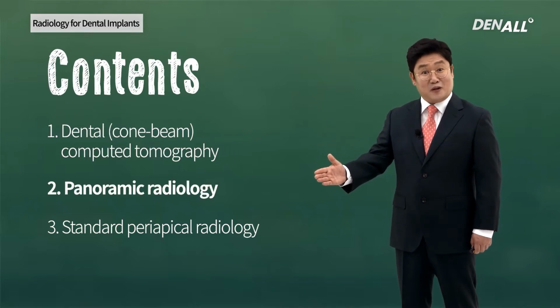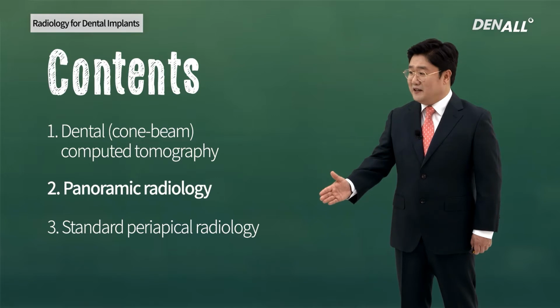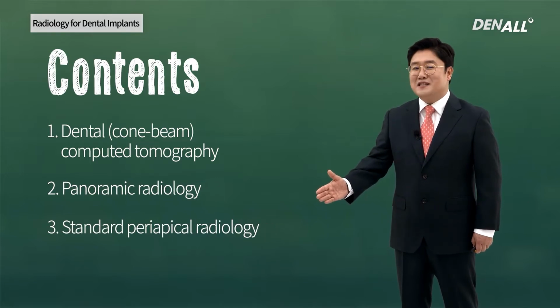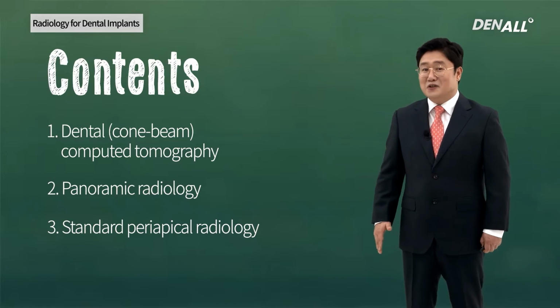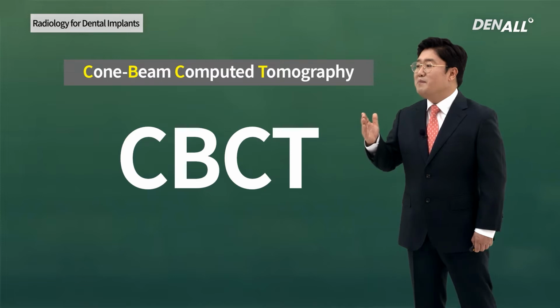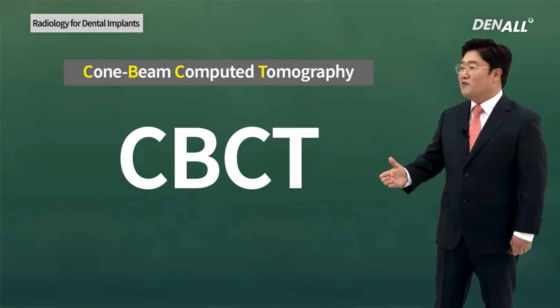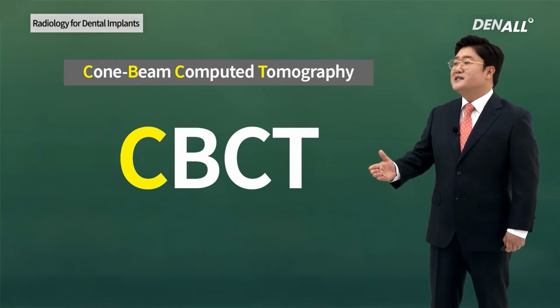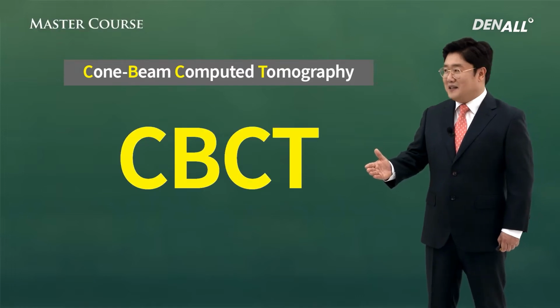Panorama, which you already know well. 3. The standard periapical radiology procedure. First, cone beam computed tomography. It is abbreviated to CBCT.